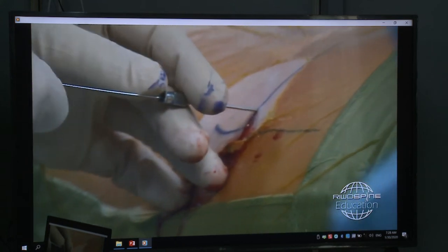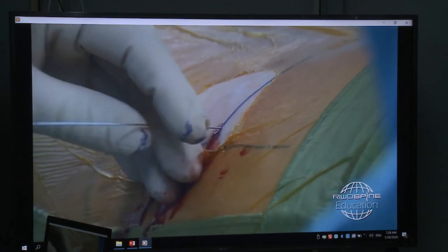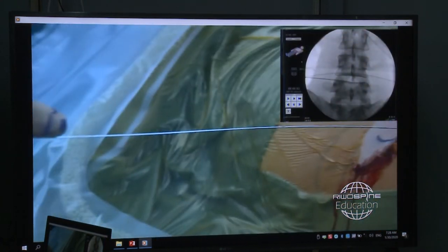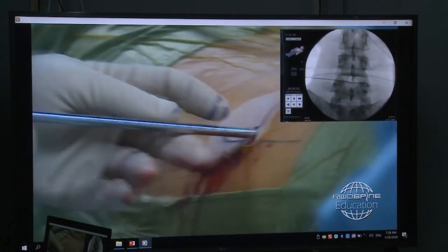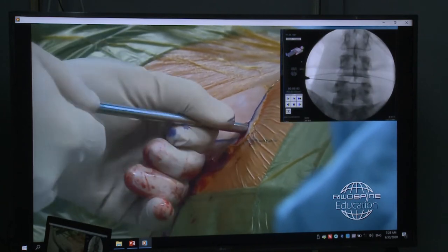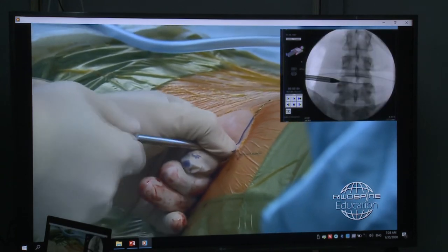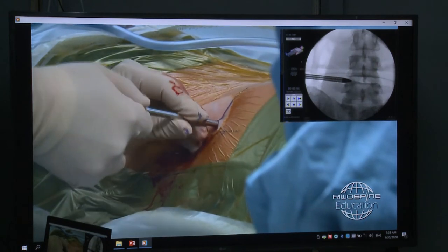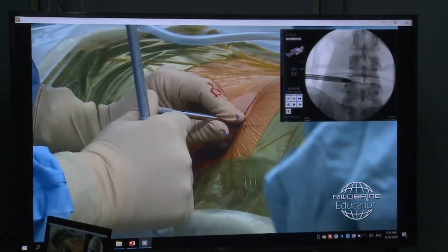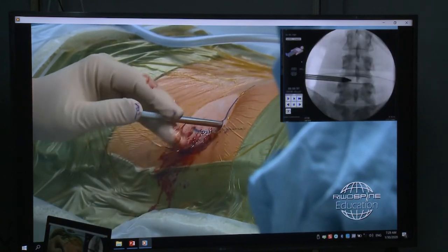So I put in the guide wire, and the needle comes out. The guide wire stays in the patient. Then we introduce the dilator. It's the same dilator as with the interlaminar approach. No change. Make sure that you really keep the direction of the guide wire. Then we pull out the guide wire, and the rest is done with a hammer. So now it's quite fixed here.